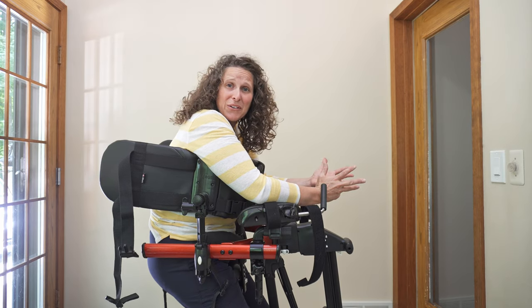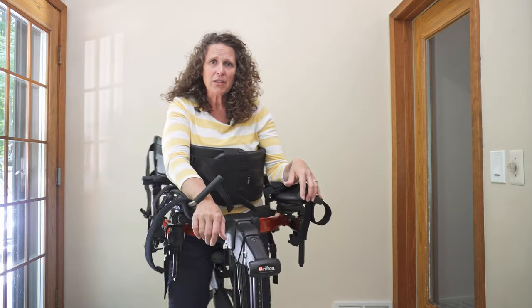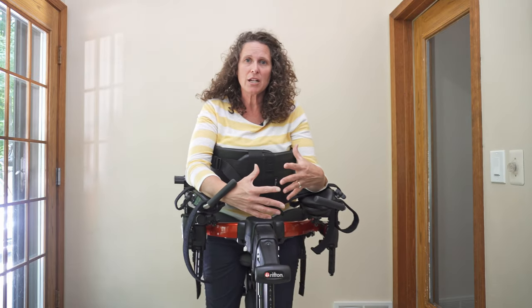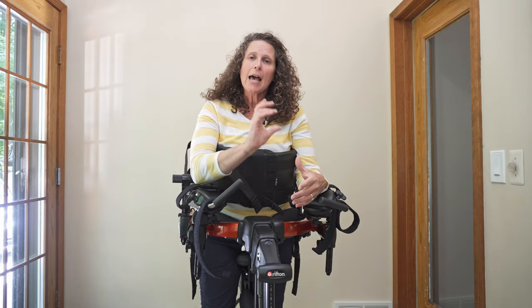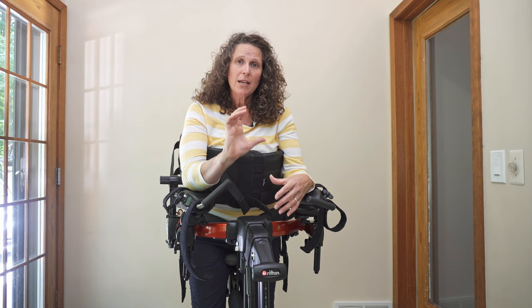Their head is down so they can't engage with their environment. What I'd like you to start with is to really think about the position of their pelvis. I don't think that to start with we can do a whole lot to change that posterior pelvic tilt that they have, so we're going to allow for that.